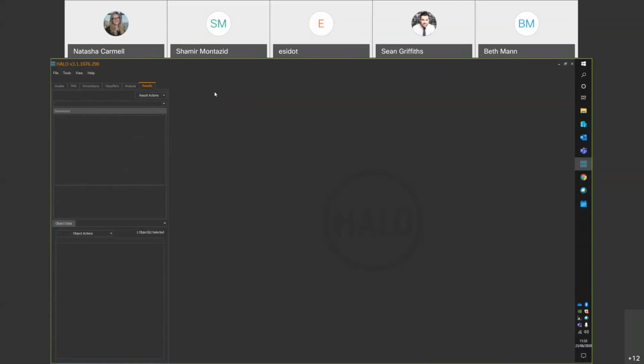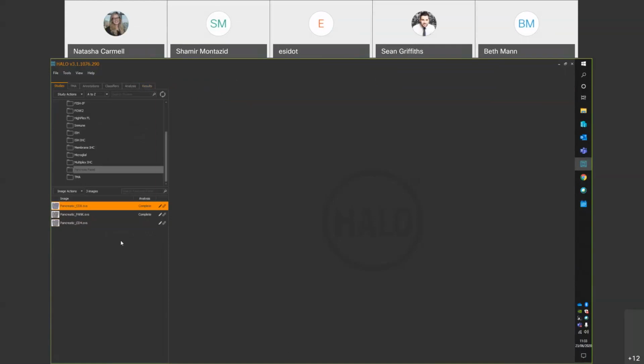The other option, which is all combined within the registration module package, is the option to fuse serial stained images, and we call this the serial section workflow or the serial stain workflow, but it comes under the umbrella term of registration module. So that's what we're going to do now. I'll pause again very briefly to see if we have any questions, as this is the last topic to cover for this session.